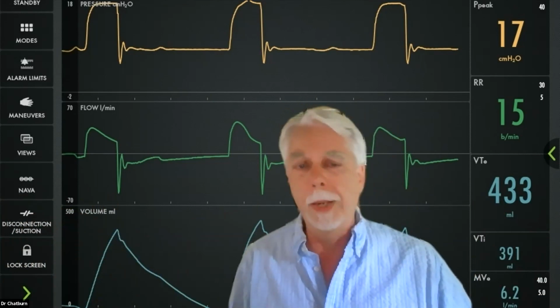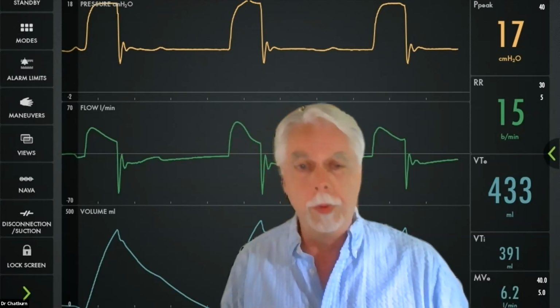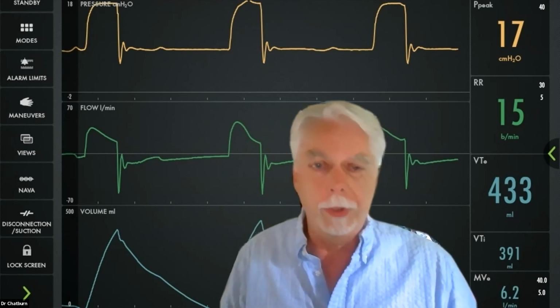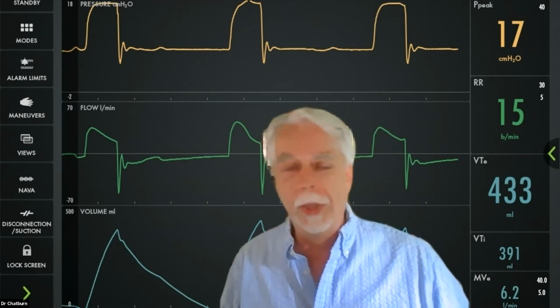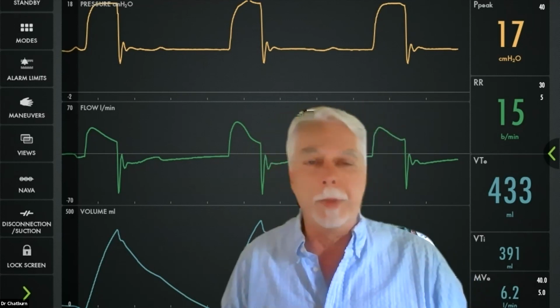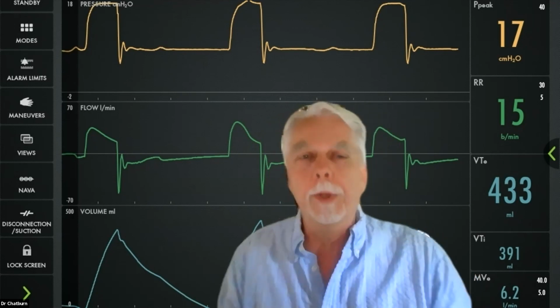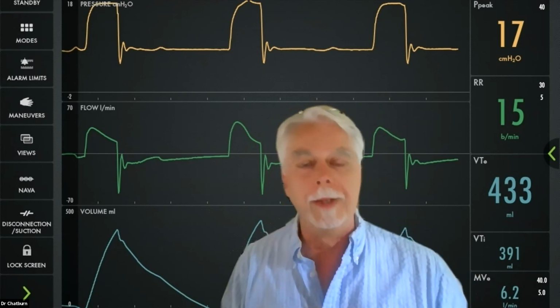And we've seen a tremendous evolution over time in achieving this, both in modes like PAV and NAVA, which are, as far as I'm concerned, as close as you can get right now in terms of synchrony. Thinking back, I've been in this business a long time, thinking back to the days when all we had was a Puritan Bennett MA1. All it did was volume assist control. And the patient didn't like that. Well, too bad. Yeah, can't argue with that. I can remember the same thing myself.